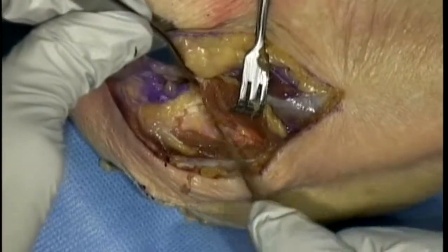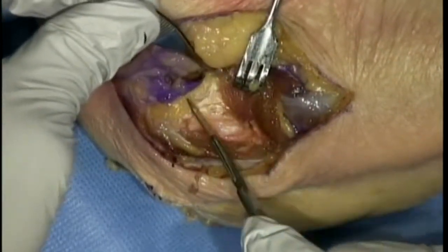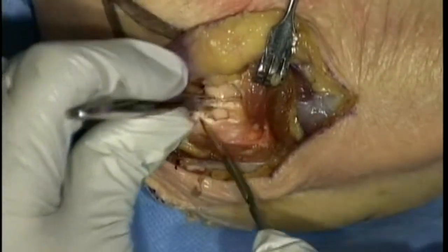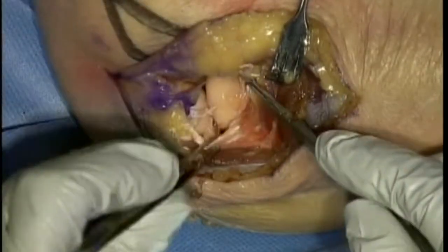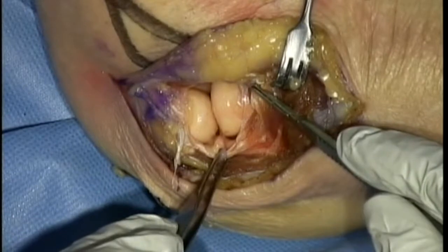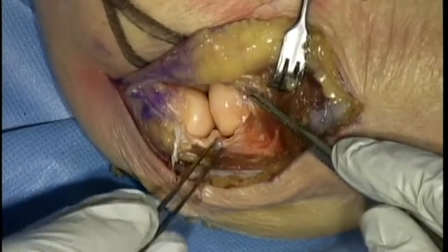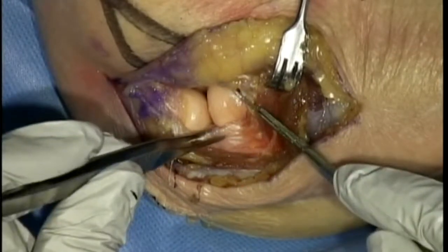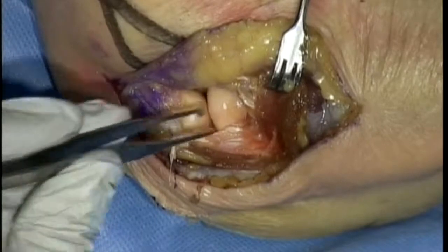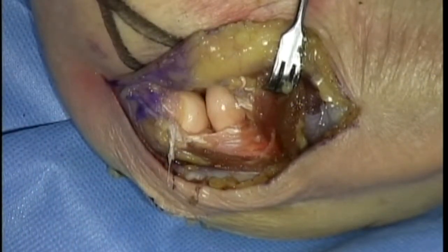So there we go. And now there's our ligament again, the LCL, and if we want to, we can just cut that. I wouldn't advise cutting it routinely, but just for an example here. But to get to the radial head, if you had to do radial head fixation through the Kocher, would you have to cut it, or would you work in front of it? Well, you could potentially work in front of it, but I must admit I like the Kaplan a lot better for that. If you're doing radial head fractures or radial head arthroplasty, I pretty much always use the Kaplan exposure. I just find it's a nicer exposure.